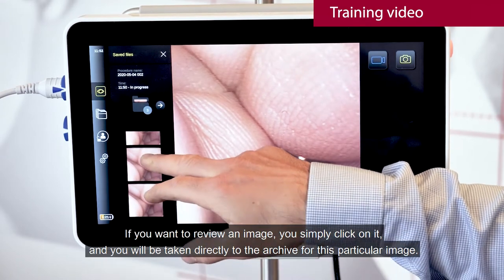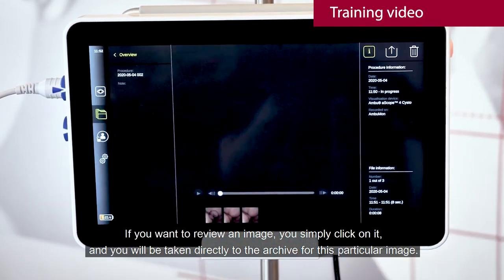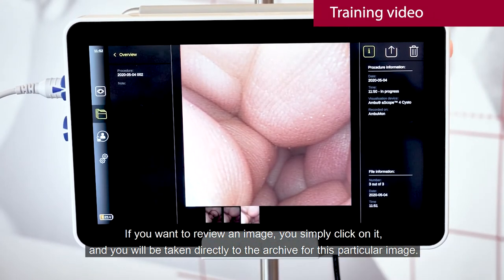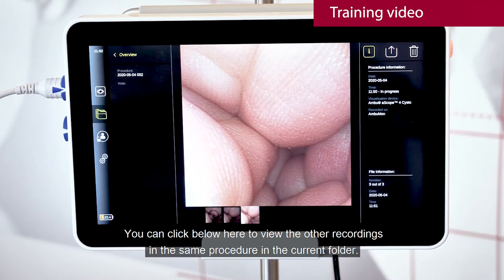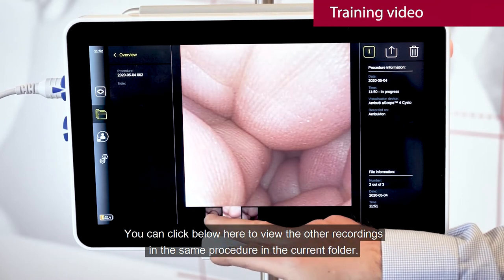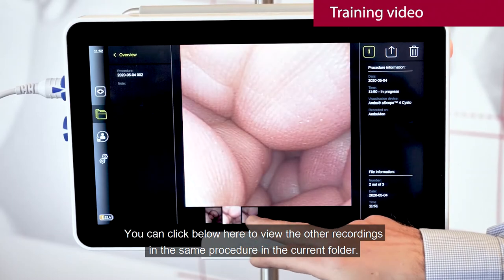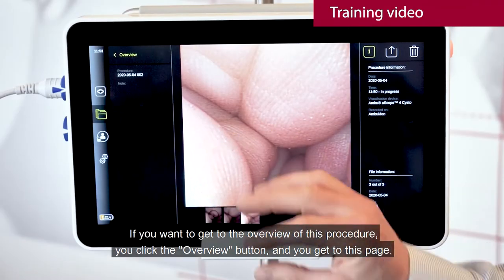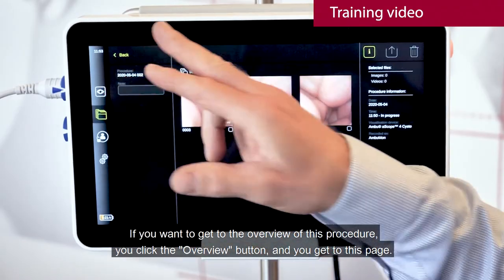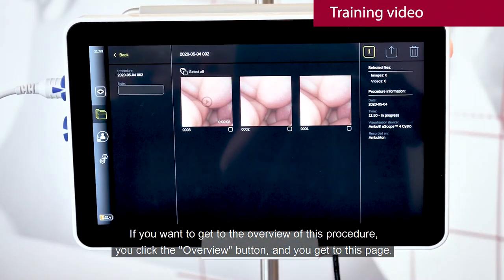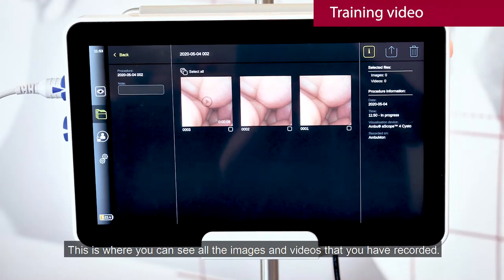If you want to review an image, you simply click on it and you will be taken directly to the archive for this particular image. You can click below here to view the other recordings in the same procedure in the current folder. If you want to get to the overview of this procedure, you click the overview button and you get to this page. This is where you can see all the images and videos that you have recorded.